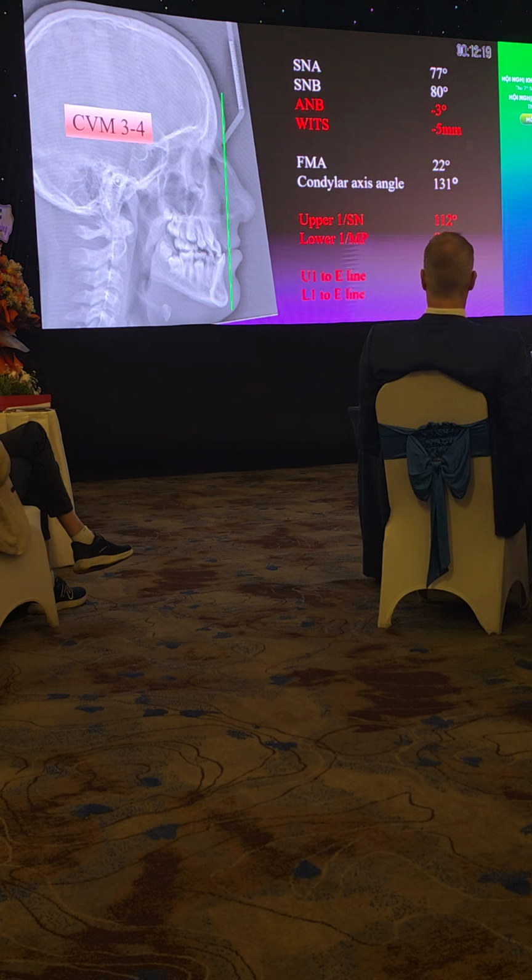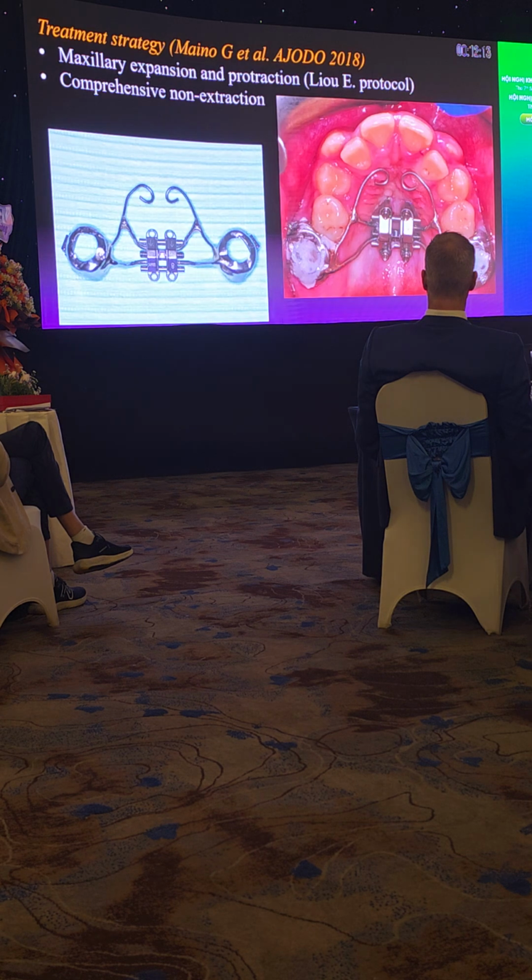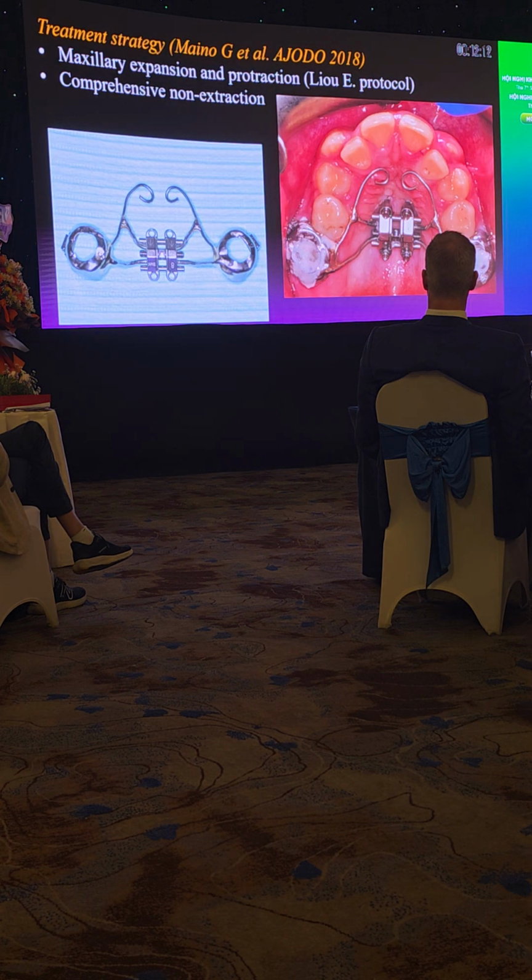All right, so you did your cephalometric analysis. It does have some skeletal problem, okay? And now, the reason I want to show you this case is not that it's a perfect case, all right? There is a problem there. Take a look at the design of this appliance.